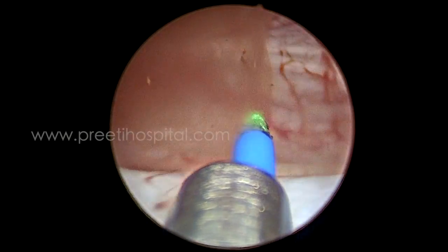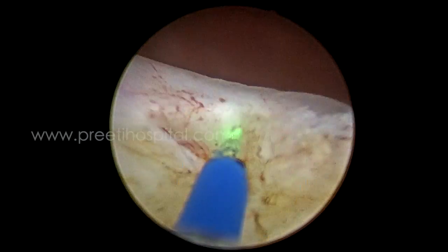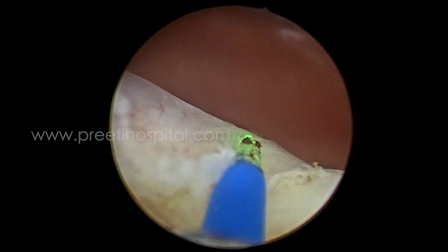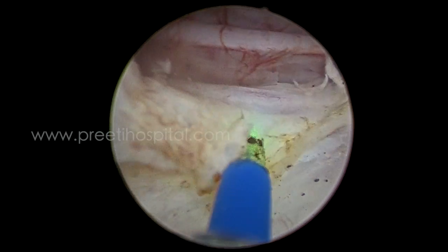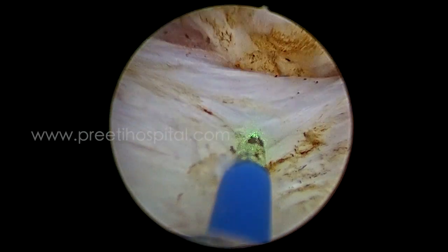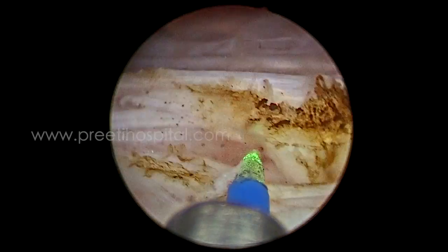So now this is the first time we are seeing this clearly. The right side orifice fortunately just escaped with some mucosal involvement. Whereas the left side orifice could not be seen for some time. The trigonal mucosa is visible here, flat against the bladder due to over-distension. Now here, this is the orifice which is looking like a nodule — this is the ureteric orifice with some amount of coagulation.